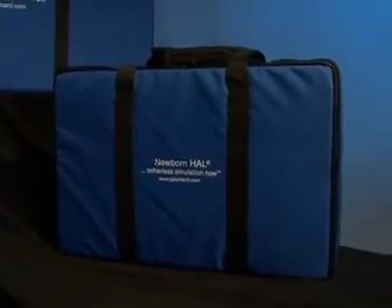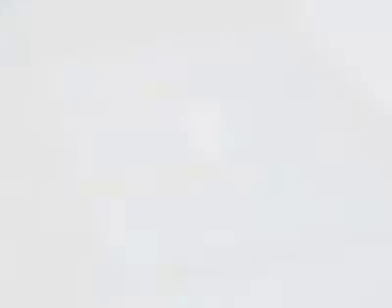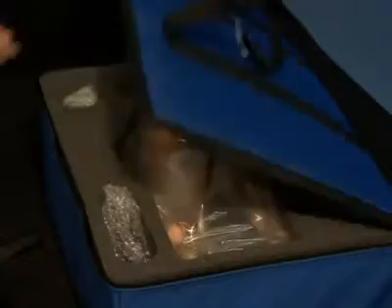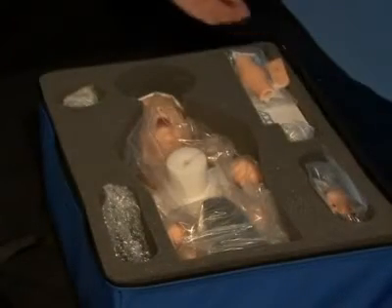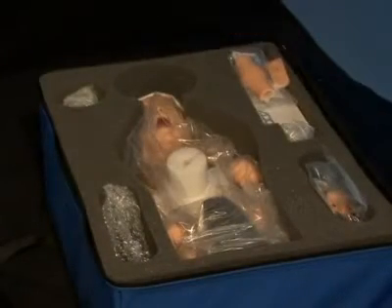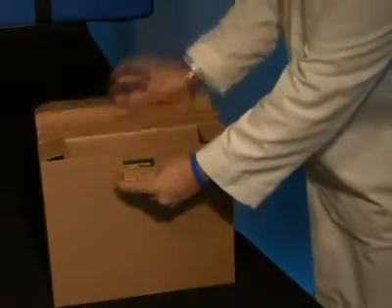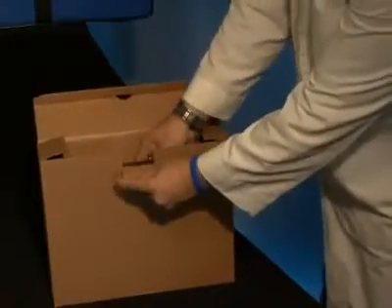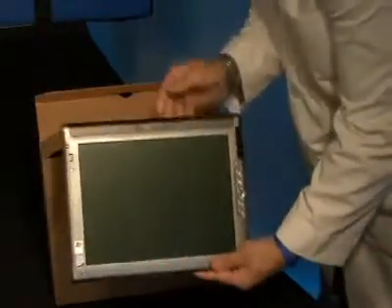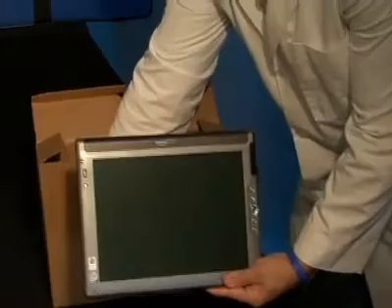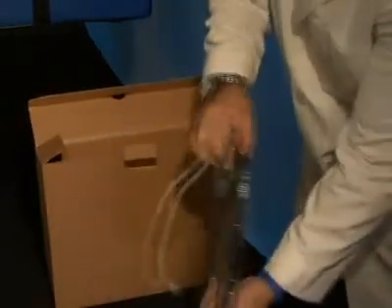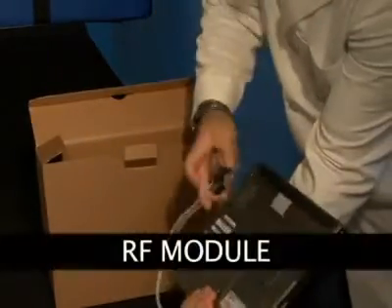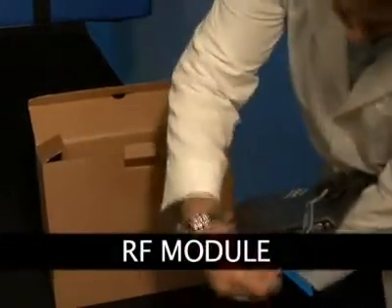The first task following the arrival of your newborn HAL simulator is to ensure you have received all the equipment and accessories. Remove the tablet computer which is packaged separately and connect the RF module to either one of the USB ports on the left side of the tablet.